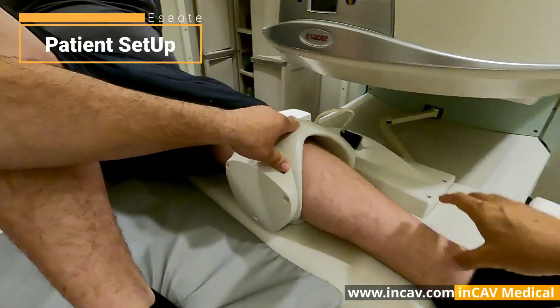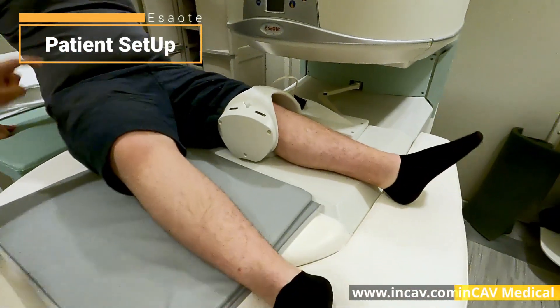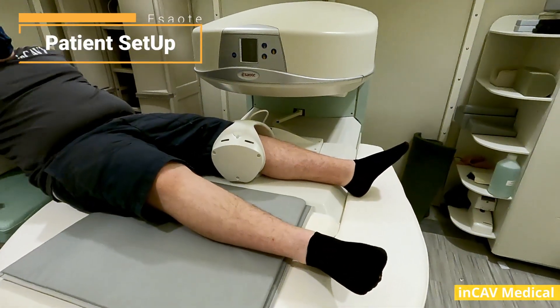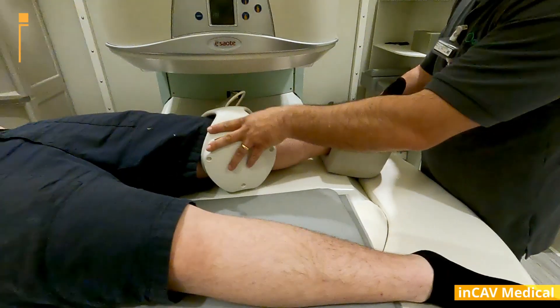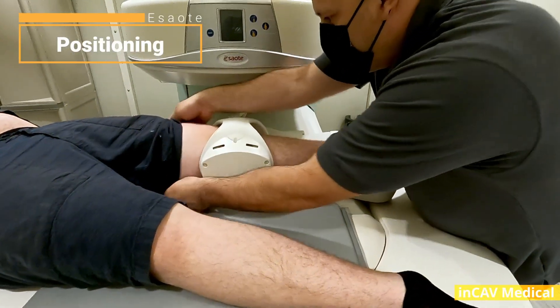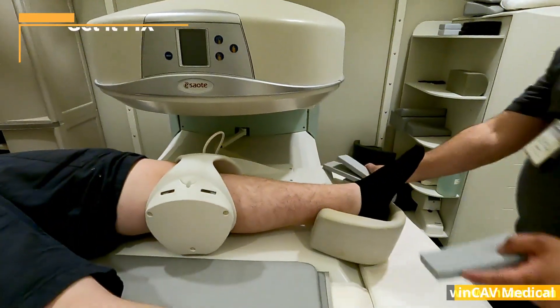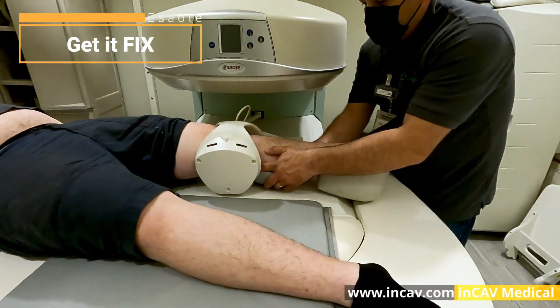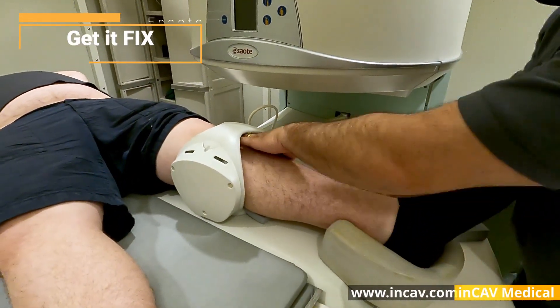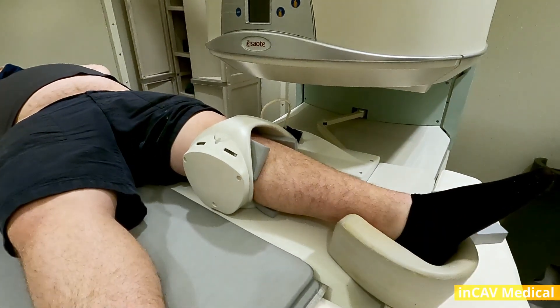Second, we need to prepare the patient. He needs to be in a comfortable position so he doesn't move, because if he moves, we won't get a useful image and may need to repeat the study. The technician will check the patient and fix the knee to the coil using special pads. It will be very important that the patient doesn't move.